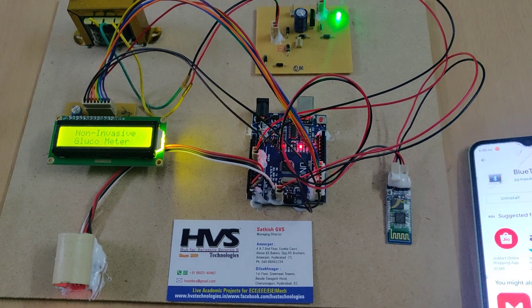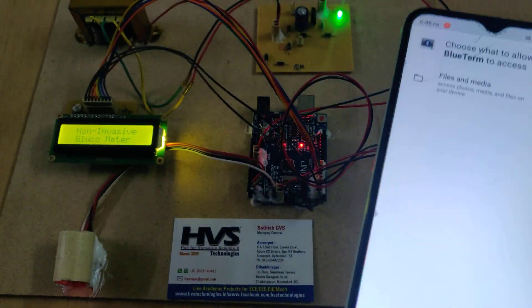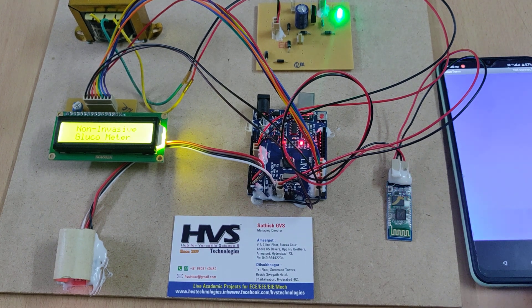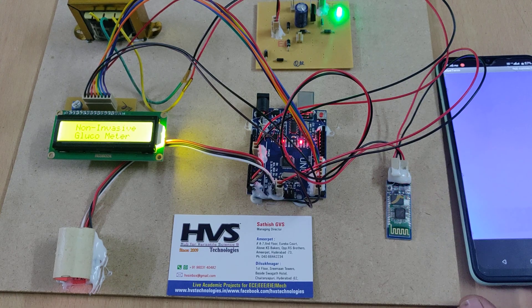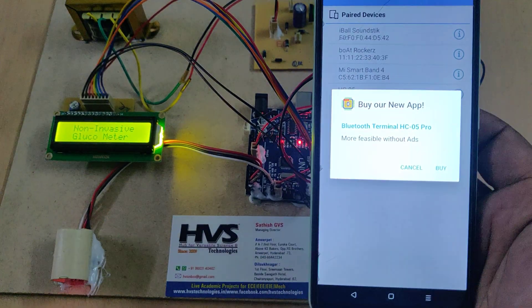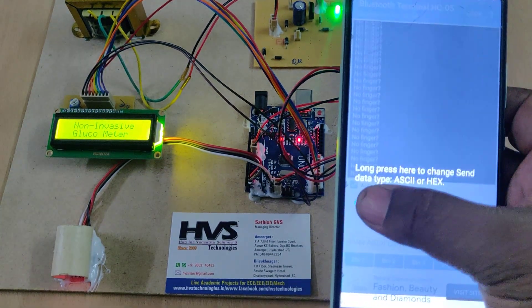Once installed, this application will work on every phone. Open BlueTerm, go to options, and open the HC-05 device which is already paired. This is the Bluetooth terminal application used to receive data from the HC-05 module.